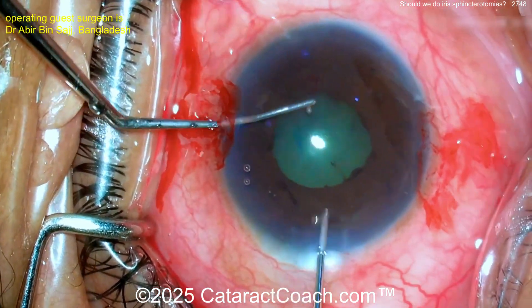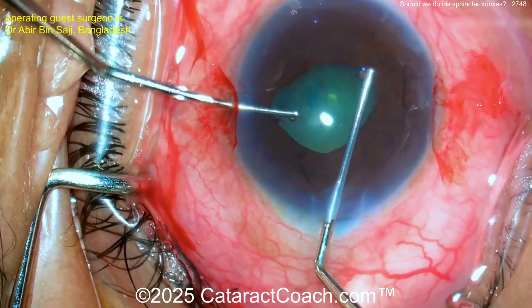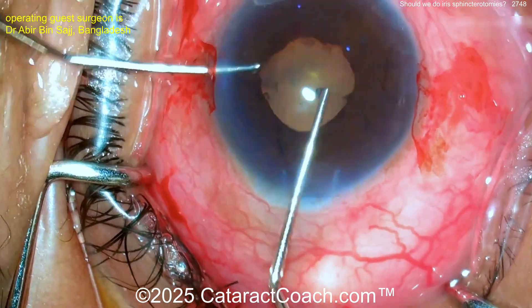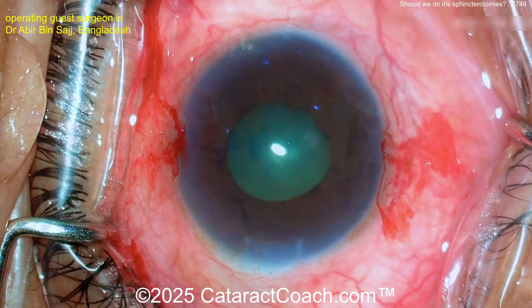Now a little pupil stretching — maybe you don't need to do anything else, right? That looks pretty reasonable. Good pupil stretch here. And now let's see — more viscoelastic.